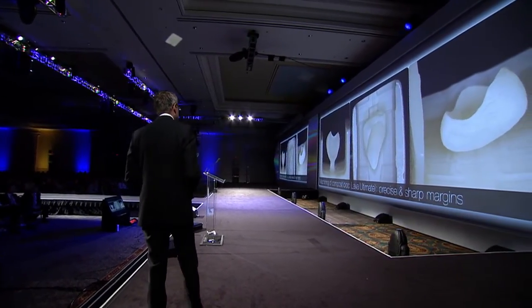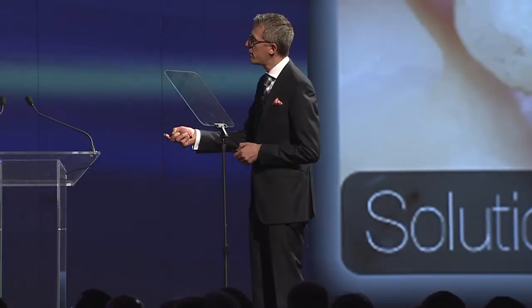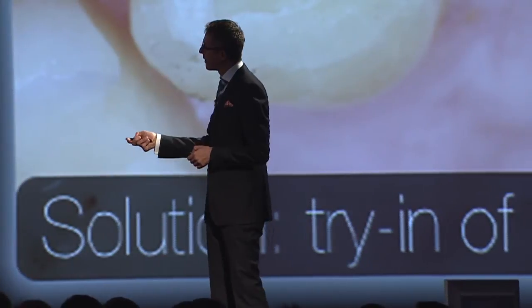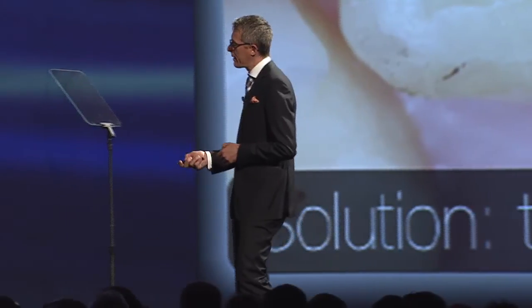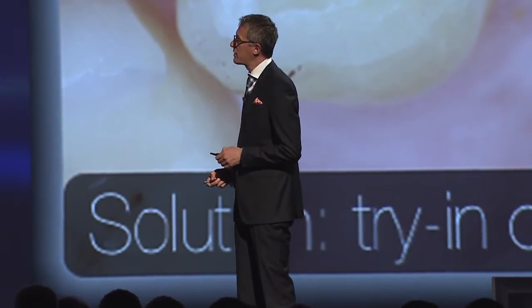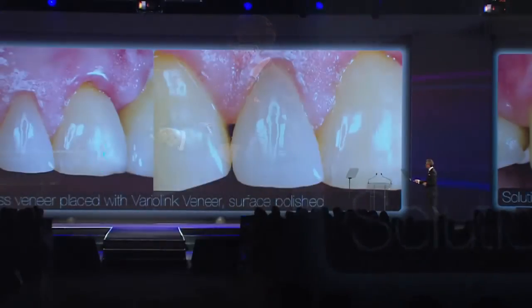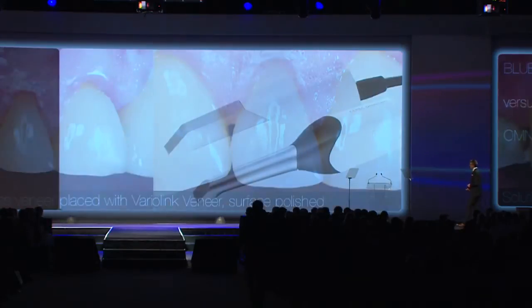So after the machining process, I removed it from the sprue, and I did the try-in of the veneer. And as you can see, again, we have a very nice fit of this restoration, slightly overextended in this area here, and I reduced it after the placement. And for the color, I used A3, the high translucent material of the Lava Ultimate. And this is after placing the restoration, and again I used the VarioLink material here, and after polishing the surface, and here a close-up of this chairside manufactured veneer using the OmniCam camera.